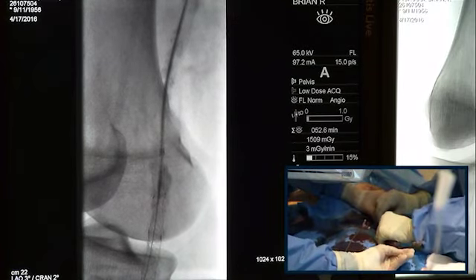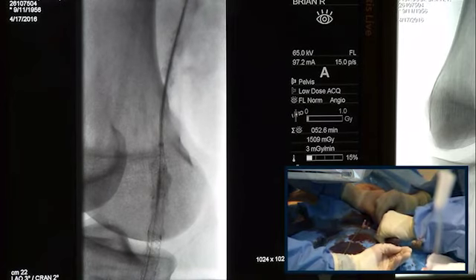If you haven't started to use these kind of stents, don't start with such a case, because this is really difficult here. You see, it's not so easy. Absolutely. And if you choose a very simple artery actually to take the stent into, it's a completely different story and very easy to deploy. However, here it's clearly difficult.